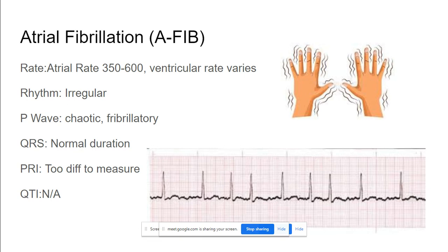So say you're doing a 12-lead EKG and someone were to have atrial fibrillation, what would you do at that time? Would you just call for help from a nurse? Well, it's not necessarily emergent at that point. They may have come to the hospital because AFib is really common, and that's usually why people end up with a pacemaker. So it's efficient enough so that they're not unconscious, but they don't have a lot of activity tolerance.